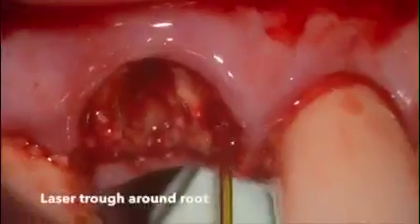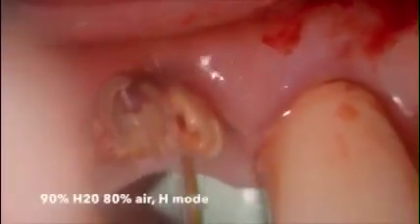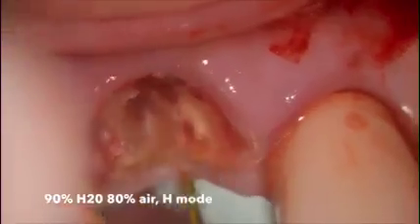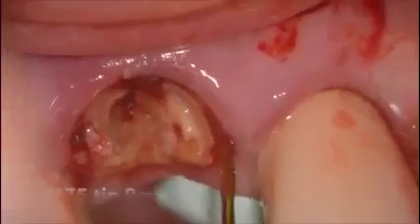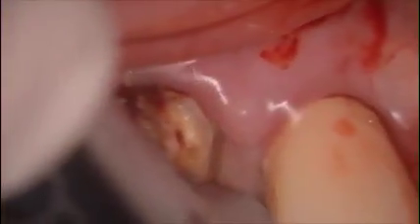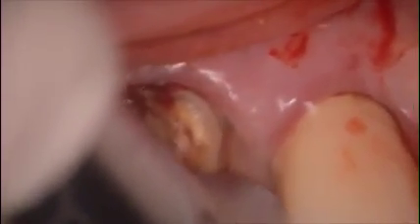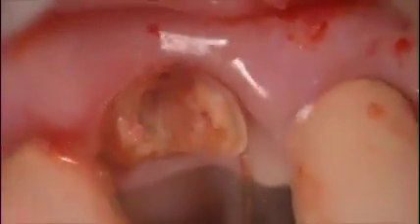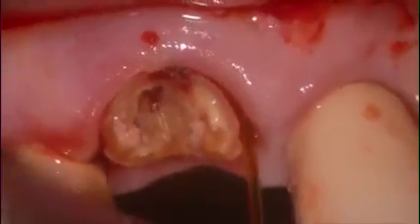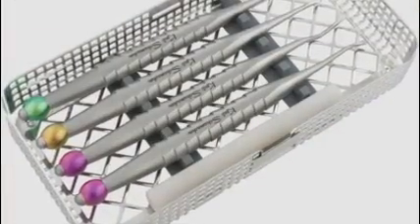It's at this point where the laser comes in handy. Using an MZ5 9mm tip we can trough around the root at 4 watts, 50 hertz with lots of water. What we want to do is go in a sewing-needle-type fashion, up and down, to create a point of leverage around the wall for either an elevator or in this case something called an approximator. You can see here working with the tip going up and down.